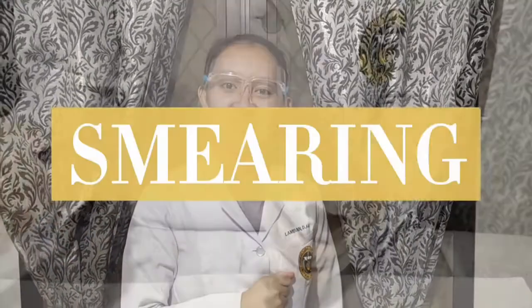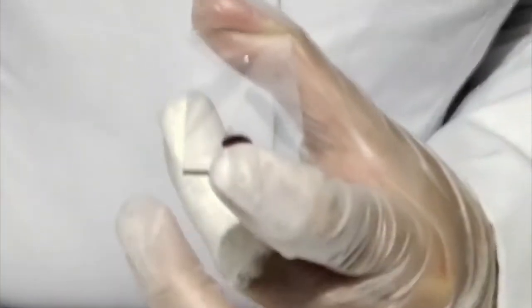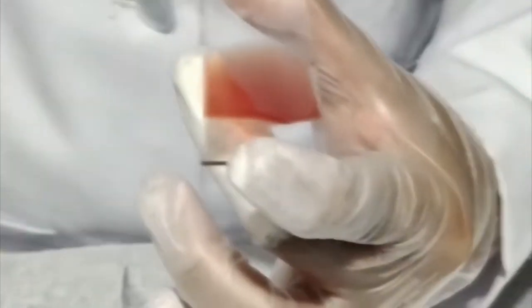So, to make a perfect smear, one must follow 4 simple letters: A, S, A, P. A stands for angle, S stands for speed, A stands for amount, and P for pressure. Now let me show you how to do it. Pour a small amount of the blood on one end of a glass slide and use another glass slide as your spreader with the correct angle and speed, and then you have it.